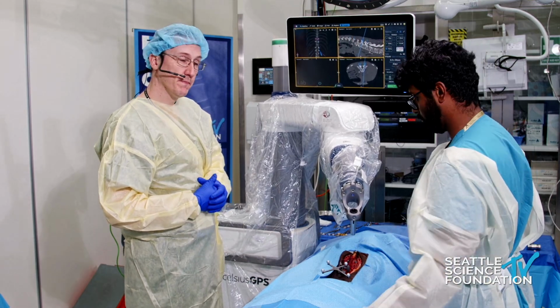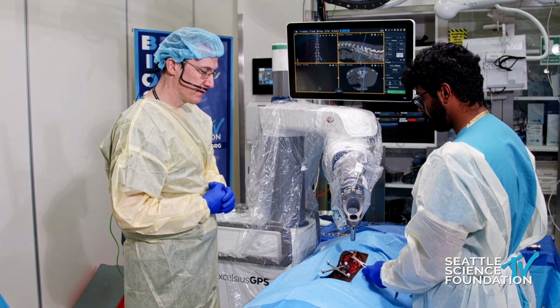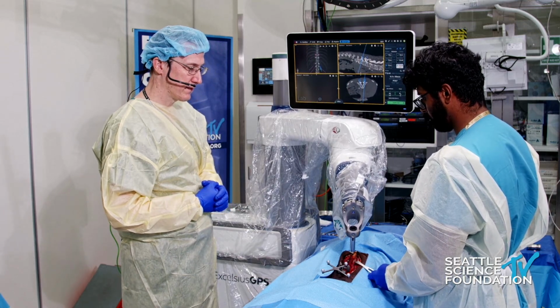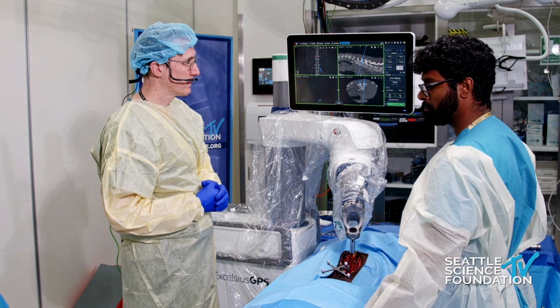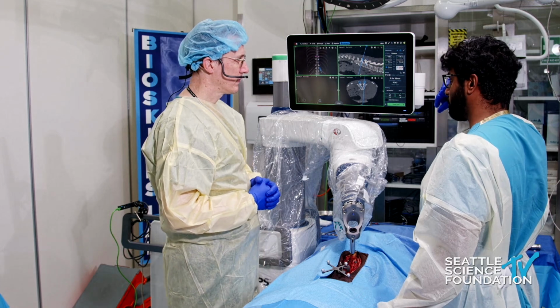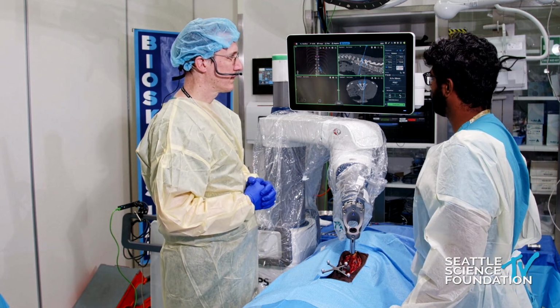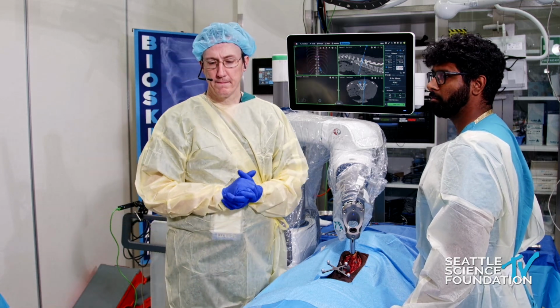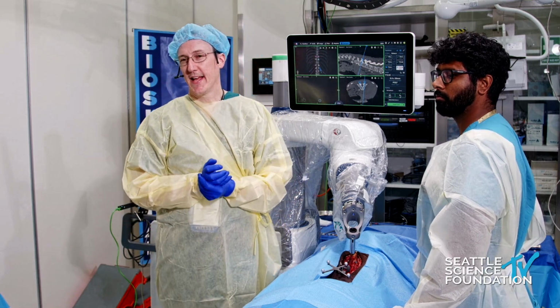Andrew, what other kind of techniques have you had to do for, say, the osteoporotic population? For example, I know for myself, I've tried to place some screws through the fractured level or have added cement sort of at both ends of the construct. Have you incorporated any of those techniques?